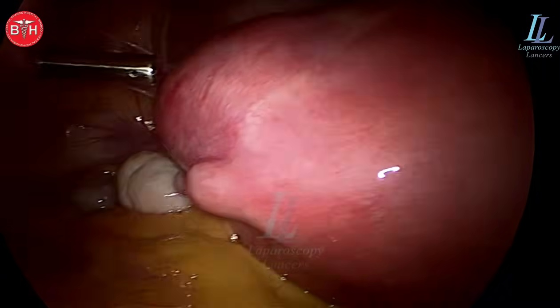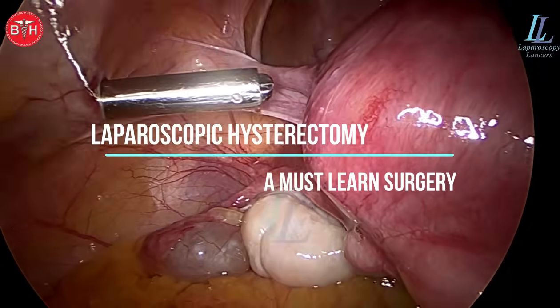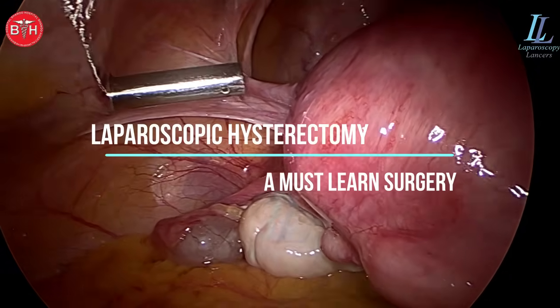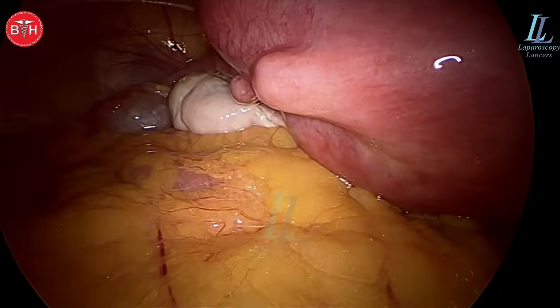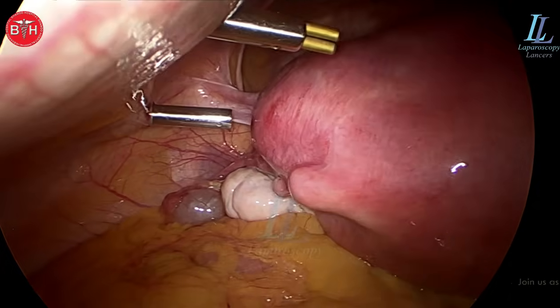Hello my dear gynecologists and surgeons, welcome again to a case of laparoscopic hysterectomy — a must-learn surgery. Why? Because an abdomen of a female should never be opened for any case of pelvic pathology, be it fibroid, be it DUB, be it endometriosis.